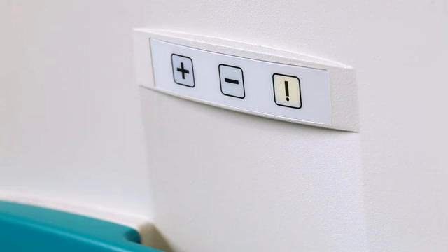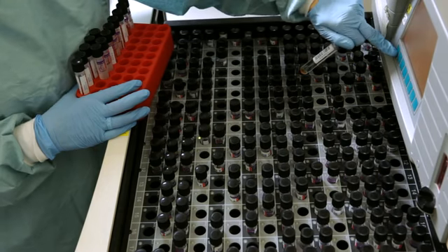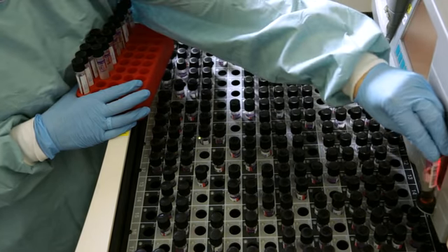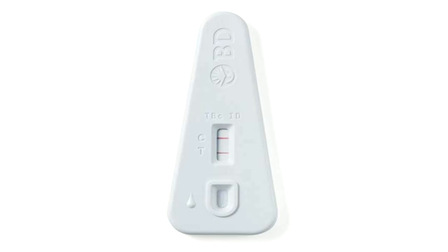The MGIT instrument will alarm when a tube becomes positive. This is removed and an aliquot is tested for mycobacterial growth by ZN staining. MTC positive cultures typically display this cording pattern. If ZN positive and the appearance on ZN staining suggests an MTC, then an MGIT TBc test is performed. This can detect the presence of MTC in 15 minutes.